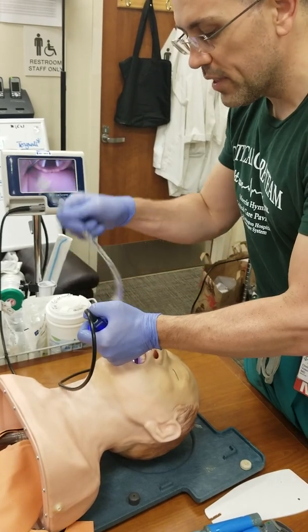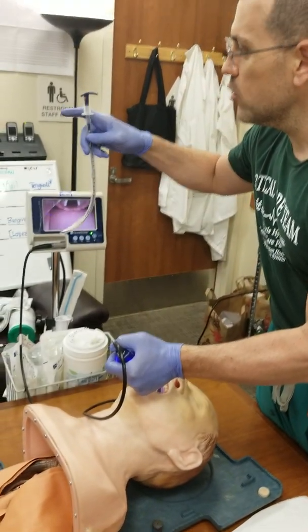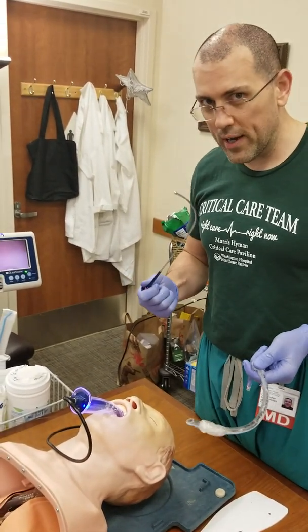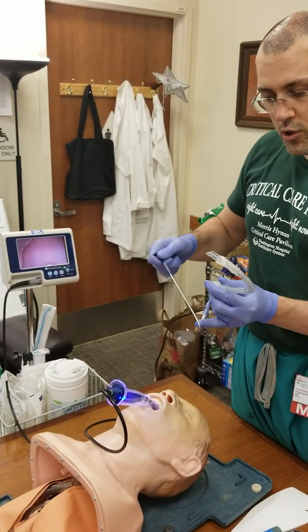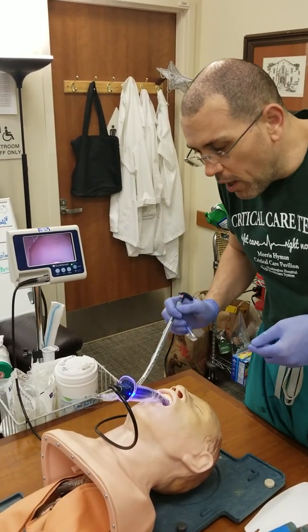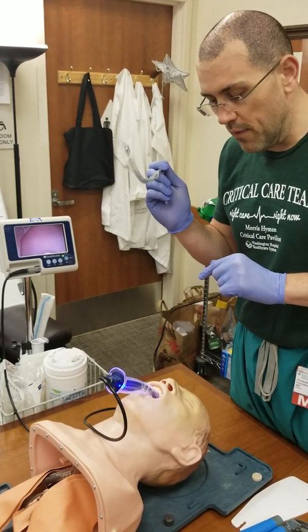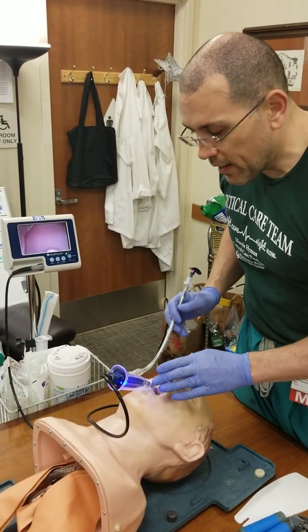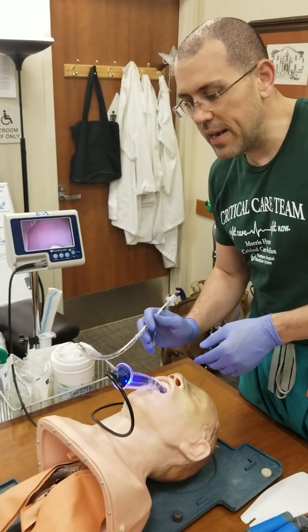One thing to notice: since the GlideScope is so curved, you have to use the rigid stylet that comes with it — not the regular flexible stylet. You have to use the rigid one because it is more curved, and when you get in there, you can manipulate it to go up and under to get where you need to go. You need that rigidness. Notice how it's curved well upward. When you come in, you can hit the anterior part of the trachea and may not be able to progress further because you're hitting it right there.